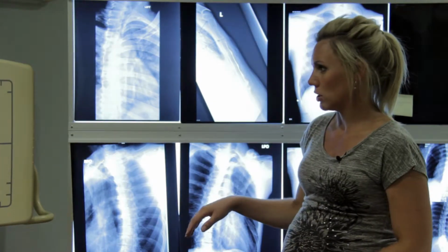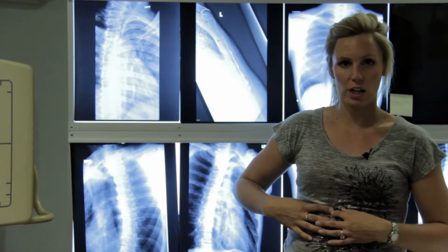For your upright pictures, if they're BBs on the front, you'll do all the pictures facing the board. If the BB's closer to the back, you'll do all the pictures with the back on the board. So there are a lot of things that are built in that make it very consistent throughout. So does anyone have any questions so far about the basic protocol? Anything at all? Pretty straightforward once you kind of hear it get explained. So PA chest, 3 uppers, 3 lowers. Every time, okay, if they can stand.